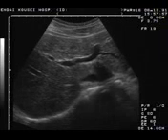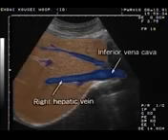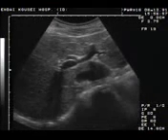In the liver, the portal vein and the hepatic vein can be seen. The portal vein appears to be complexly bifurcated with edges. The hepatic vein is often not edged and runs radially, with the inferior vena cava as the center. The inferior vena cava is almost perpendicular to the portal vein. This procedure allows us to observe the region perfectly from the right hepatic lobe to the right kidney. Check for tumours in the liver, abnormalities in the parenchymal echo, and dilatation of the intrahepatic bile duct, the diameter of the hepatic vein, and the portal vein.